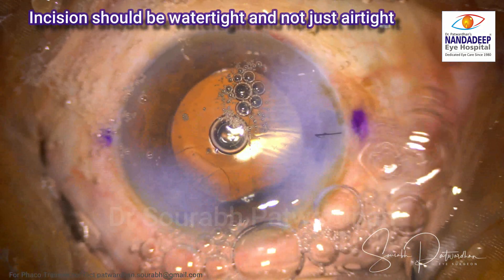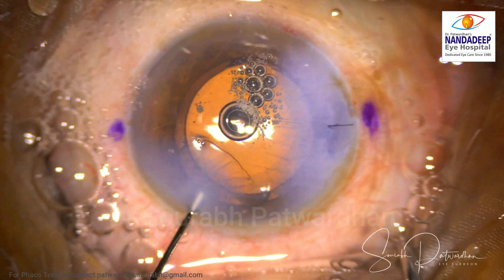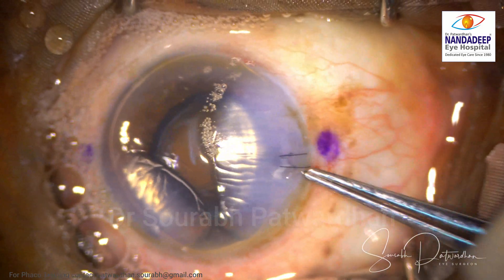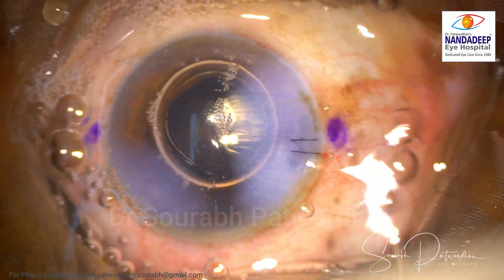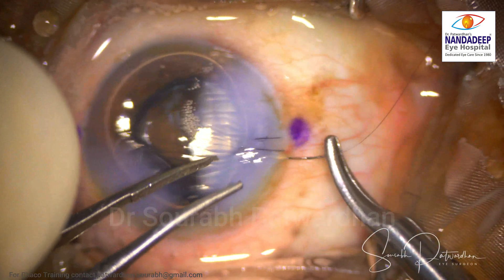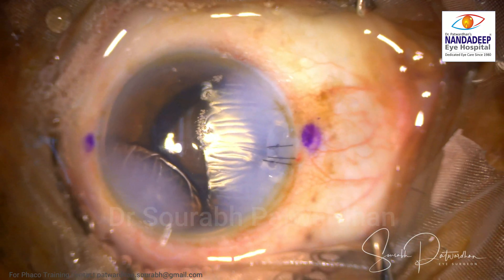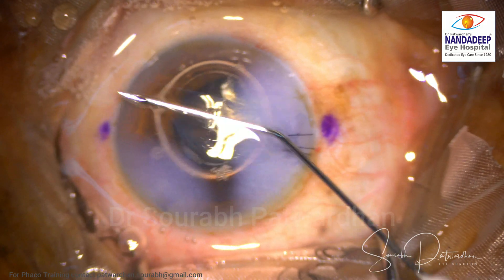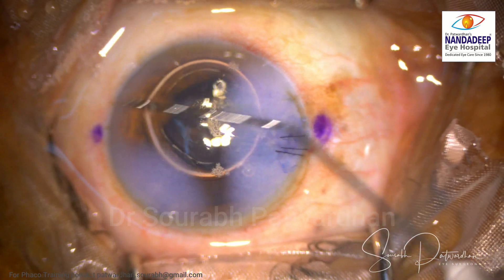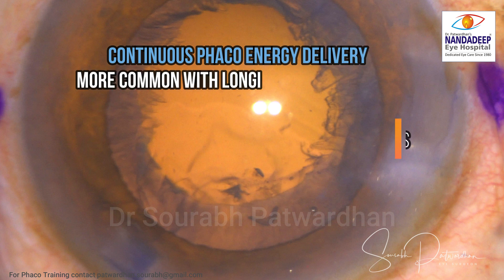The way to deal with it is to suture. I had made the first suture but it was still leaking, so in these cases you have to take multiple sutures because we want the incision to be watertight, not just airtight. If you put air in the anterior chamber the leak will stop, but as the air gets absorbed it will leak again. Even after two sutures there is still leakage, so I had to go for a third suture. After the third suture was put I could form the anterior chamber and it was not leaking. I left a little bit of air bubble and asked the patient to lie on one side. I patched the patient for a couple of hours and re-examined — this patient did very well after the suturing.